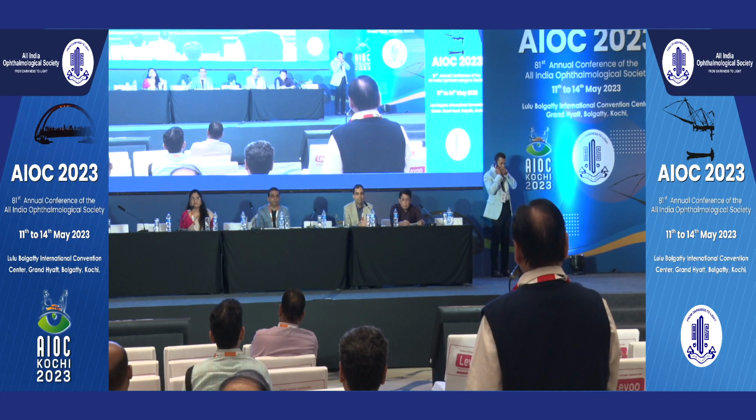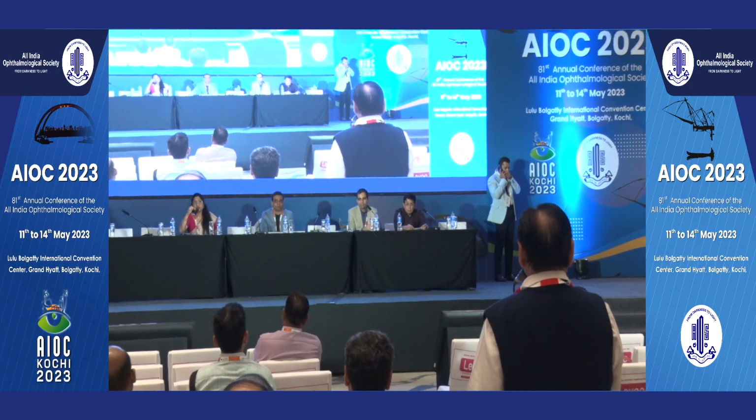Would it not recur? Which is exactly what I said: if we believe that we can treat it, we go ahead. This particular case was because of extensive contact lens use. But if we believe that this is a severe case and cannot be treated, we must absolutely not implant a multifocal lens. That's my point. So you are absolutely correct, sir. We must absolutely not implant it if we believe that we cannot treat this problem. And I have trifocal, I can see very clearly. Wonderful to know that, sir.